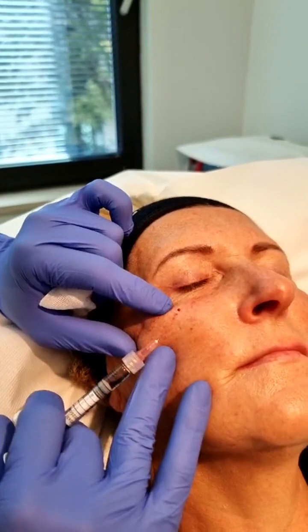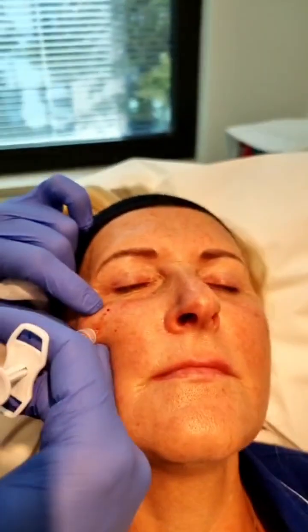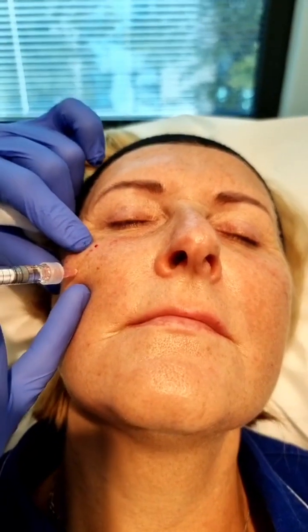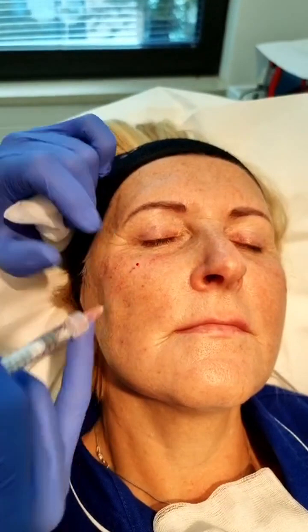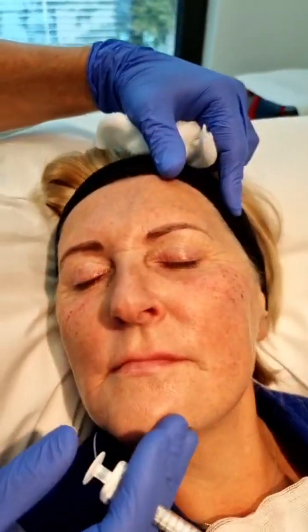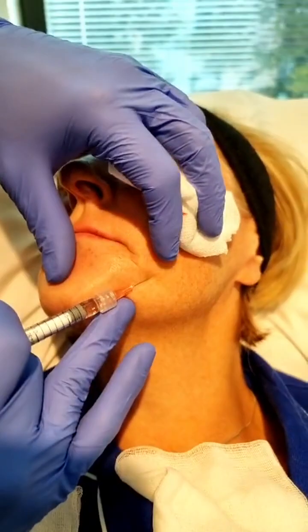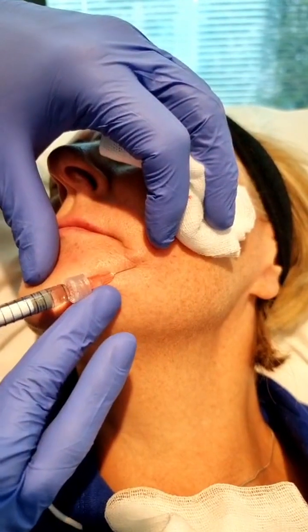Then nasal jugal groove, McGregor's patch, zygomaticocutaneous ligament just underneath. This is golden point. That's it. See, strength, volume, correction. And something left. So let's do some fern. You can see an immediate shortening of that linear dermal weakness.